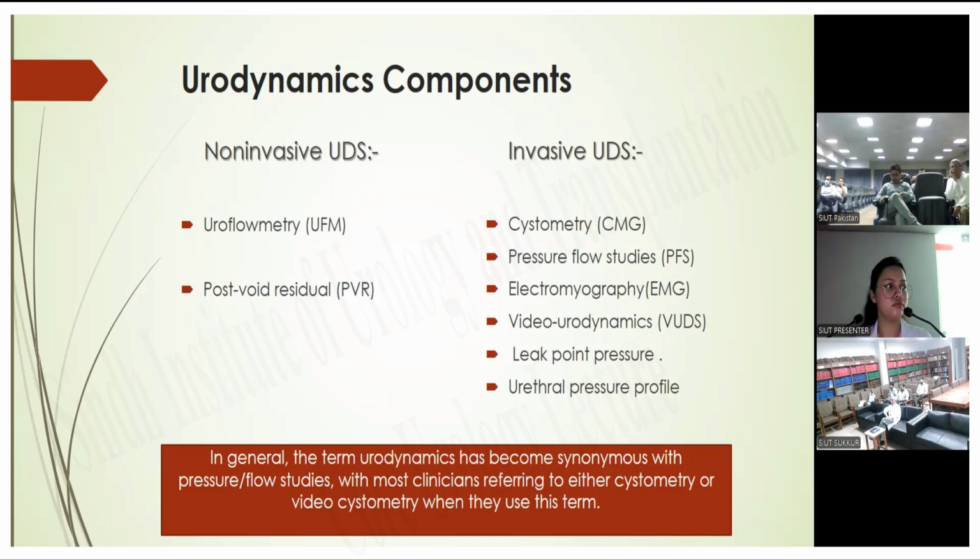Yes, sir. So I think you people can go into that. With a few modifications in that machine, we can do that as well. Yes, but we are not doing it, and sometimes we arranged a few workshops and the experts came here and said that the advantage of this finding is not too much, but we can do the urethral pressure profile on this machine as well.